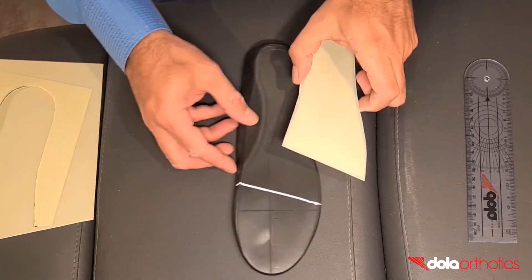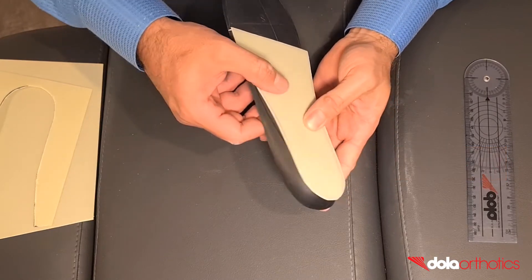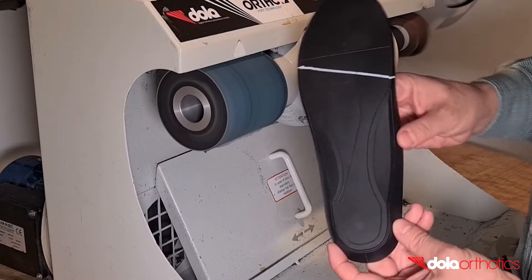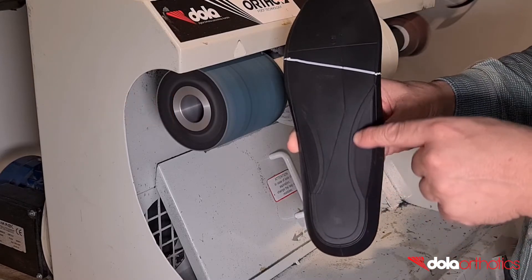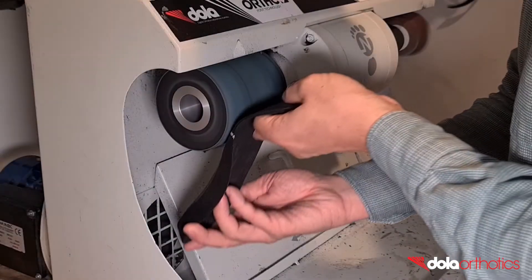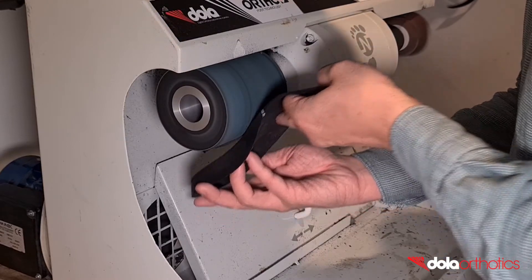Double check the size of the gait plate against the orthotic. The flat planar surface of the DOLA Pro is designed to make the addition of planar modifications in-clinic fast and easy. To aid in gluing, roughen the surface of the orthotic where the gait plate will be adhered to. Start with grinding the anterior border near your guideline then connect to the heel. This roughened surface will improve the adhesion of the plate to the orthotic.